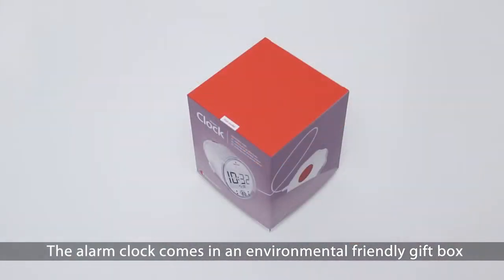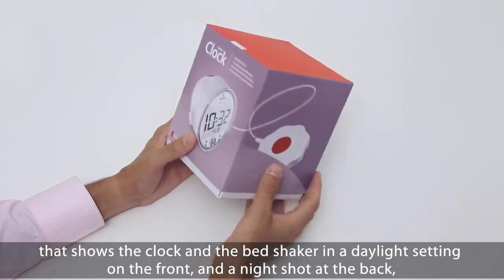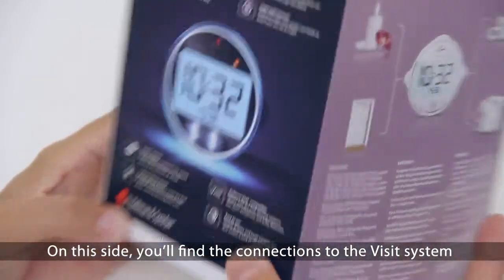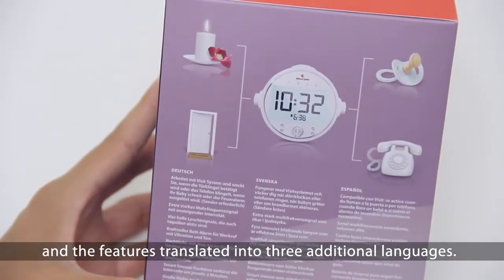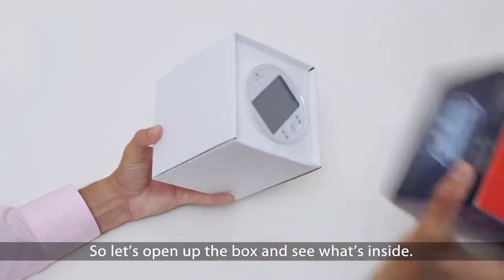The alarm clock comes in an environmentally friendly gift box that shows the clock and bed shaker in a daylight setting on the front and a night shot at the back, combined with all the major features. On this side you'll find the connections to the Visit system and features, translated into three additional languages. So let's open up the box and see what's inside.